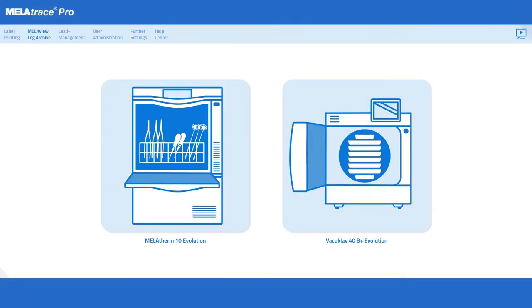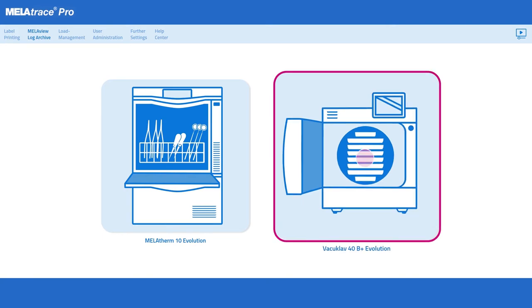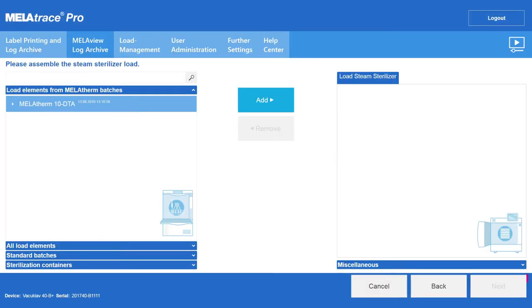The open autoclave on the start screen symbolizes that the device is ready to be loaded. Please click on the device icon to start with the load process.